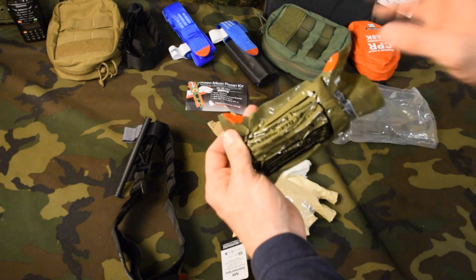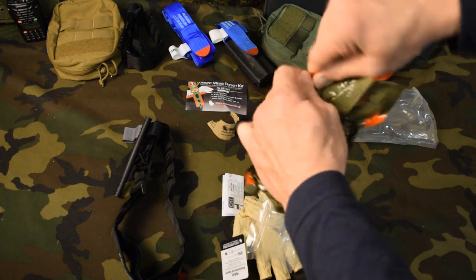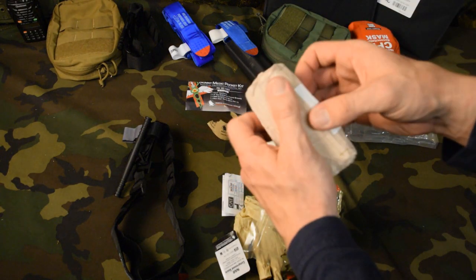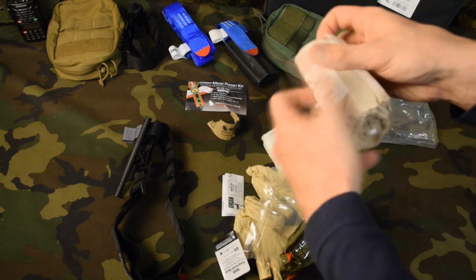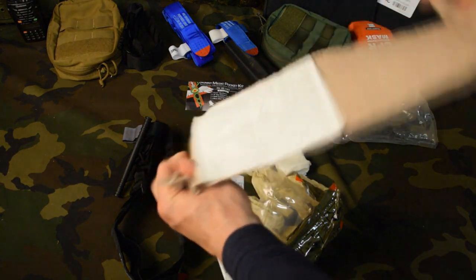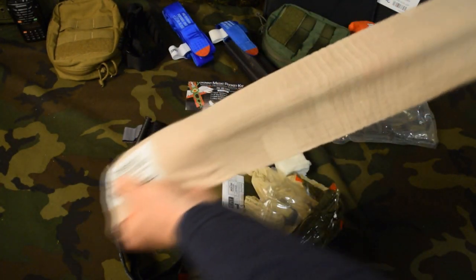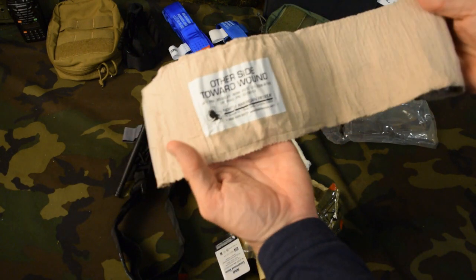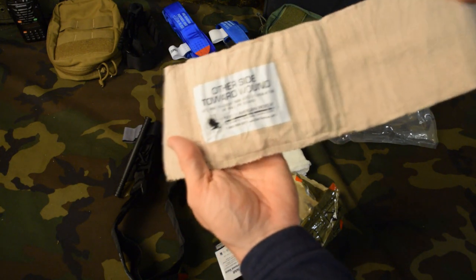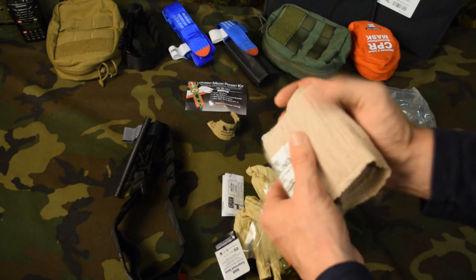Another item included in this kit is the four-inch trauma dressing. It has some tear points so we can open it up. This is pretty similar to the Israeli bandage that people might be familiar with — it's essentially a big fancy ACE bandage. We can place our wound here, wrap this around, pulling it tight to get some compression. This is a compressed bandage so we can really get some pressure on a wound to help control bleeding. Abdominal injuries, chest injuries like a flail chest — all can be bandaged using this bandage.